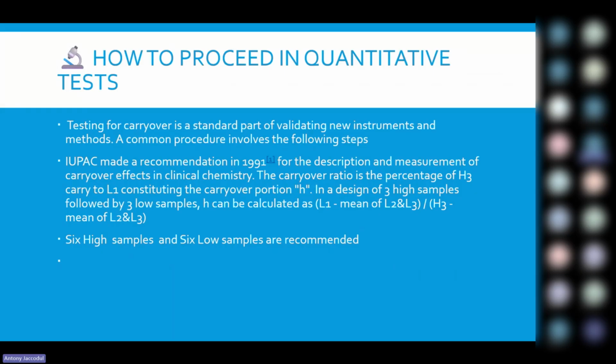And remember, our current standard is a risk-based approach to our testing. So it is quite important that in the testing we're doing, we look at the risk of harm to the patient as much as possible. Therefore, the carryover test is one of the important areas to look at in method verification. The first step, on the IUPAC recommendations of 1991, for example, most jurisdictions started doing this many years ago. I think it's now just getting up in our areas.